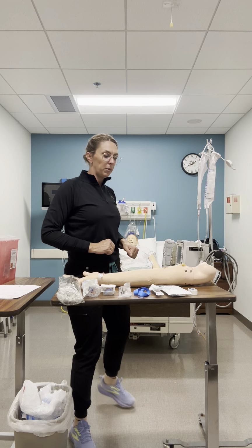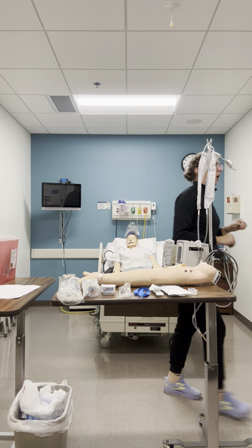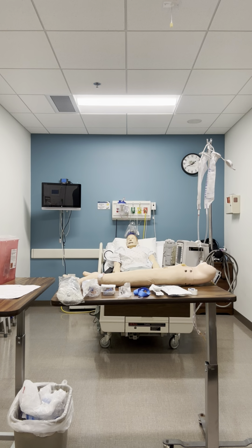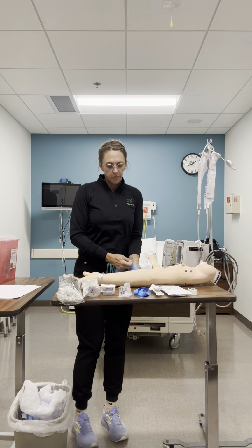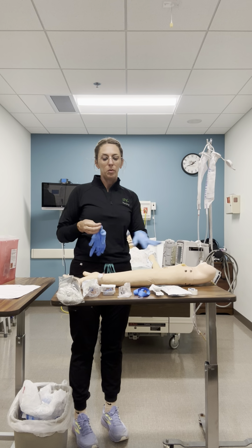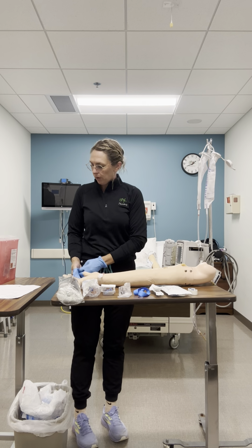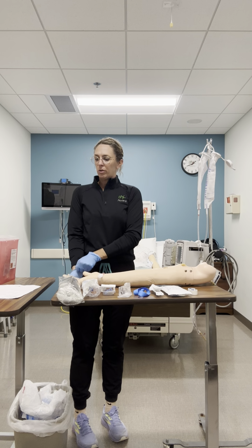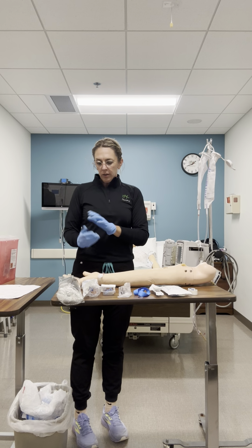So I'm going to go ahead and get my bed to a comfortable working level. Probably move that bed up so that it's nice and comfortable for me. And then I'm going to go wash my hands. And get my gloves on. I have gathered my supplies, brought them into the room and set them out already. I also have my waste receptacle and my sharps container here, so those are ready to go as well. Okay, so I have my gloves on.